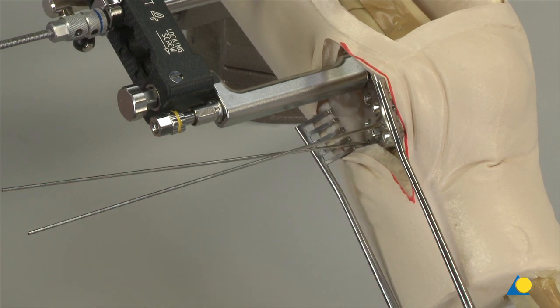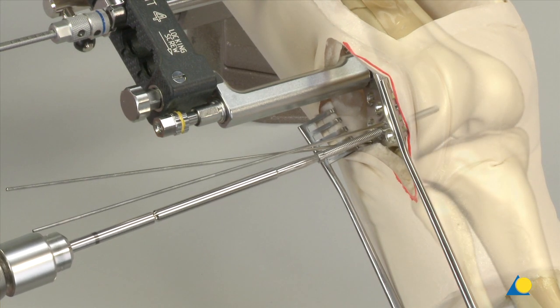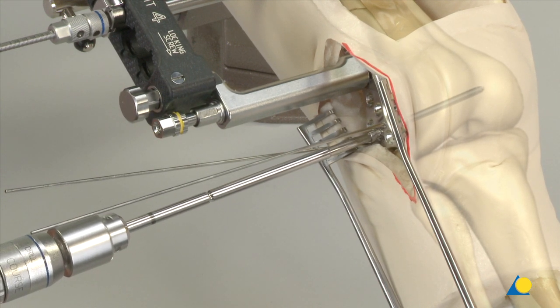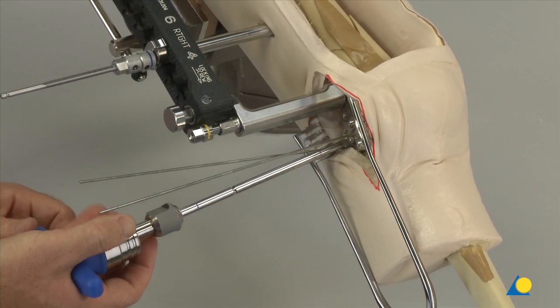Insert the appropriate length 5.0 mm variable angle locking screw using the power tool and the T25 star drive screwdriver shaft. Confirm that the screw is parallel to the knee joint and the length is correct under image intensification prior to final tightening by hand with the T-handle with torque limiting function 6 Nm.